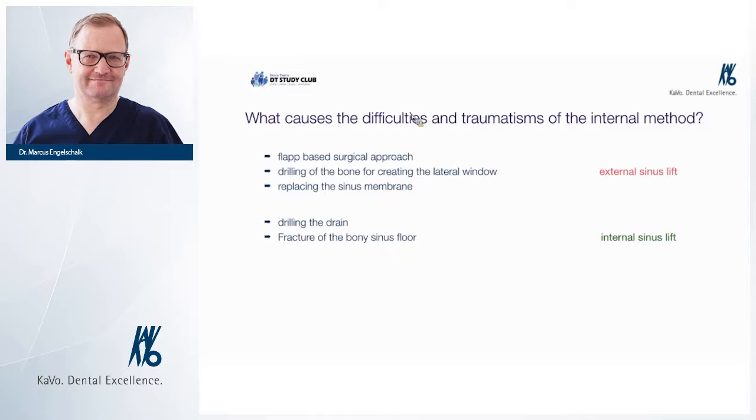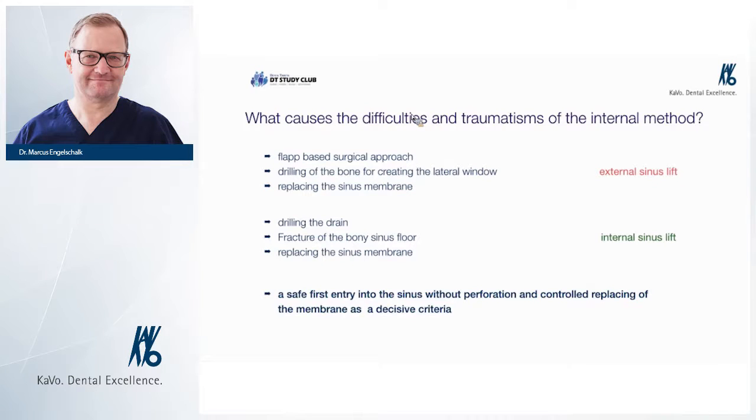So if we see this comparison, and we see the possibilities we have, what causes the difficulties and the traumatisms for these methods? Well, it's very clear to see. If you define your problem, basically we can say relatively uncontrolled proceeding and limited overview. This is for every method. Well, externally, we have the opening of the lateral sinus.